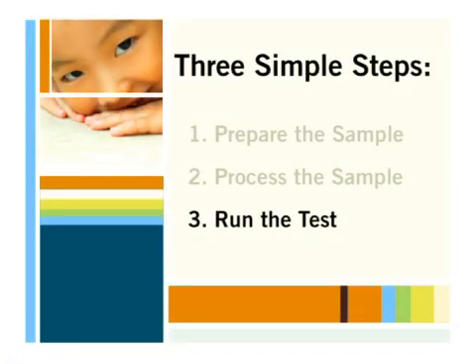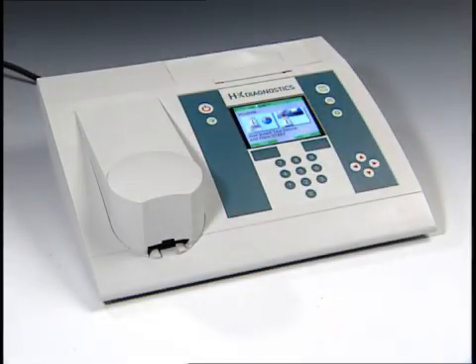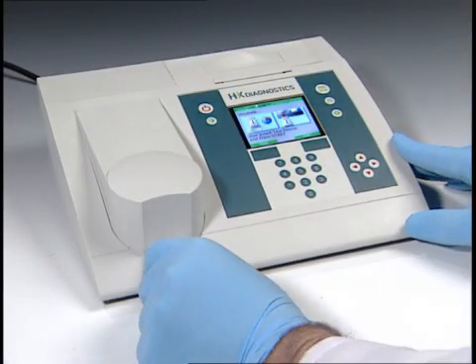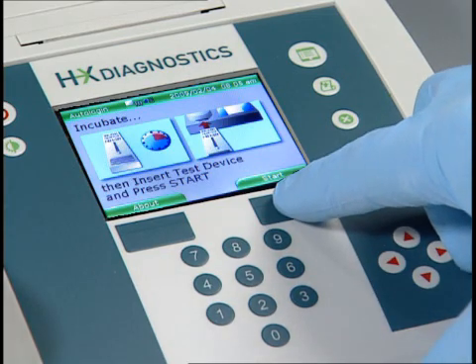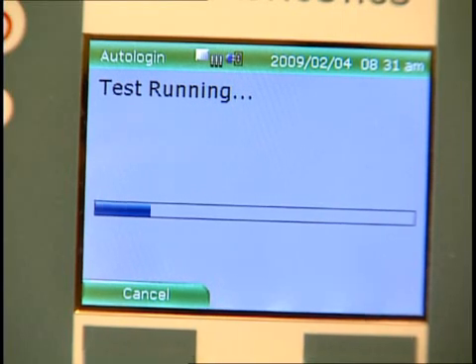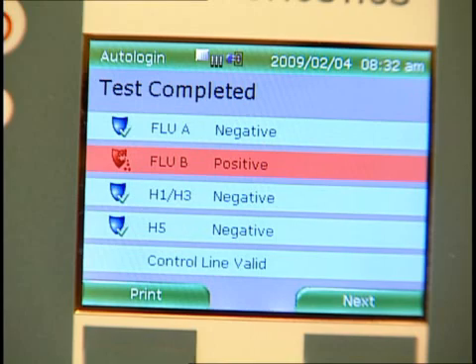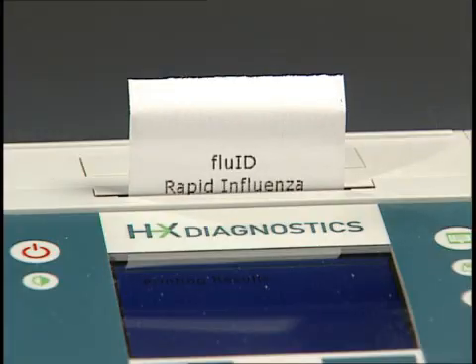Third, run the test. Insert the cartridge into the reader until it clicks, then press the start button. The reader will count down and then measure the signal from the antigen-antibody complexes on each line. The reader will then display and automatically print the results.